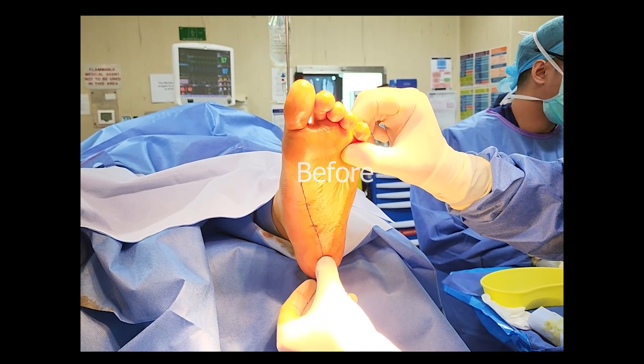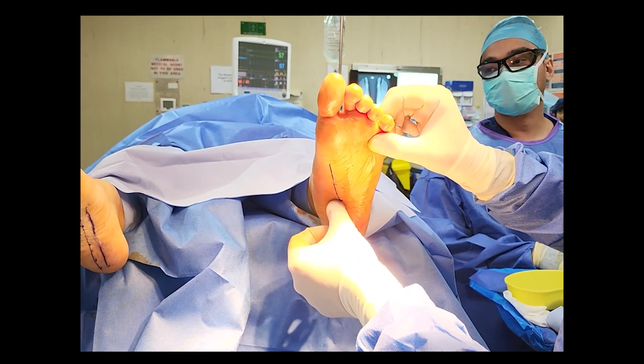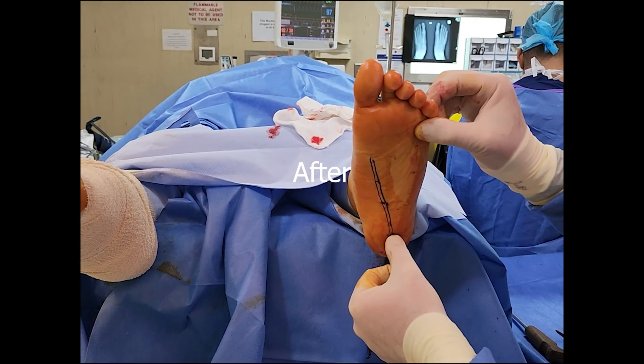The subtalar joint axis was more medially deviated prior to the implant. After the implant was inserted, the subtalar joint axis location was further lateral, but the change was definitely not as significant compared to the right.